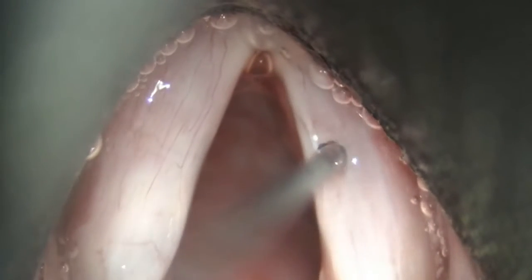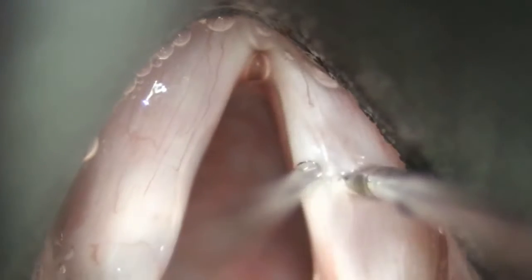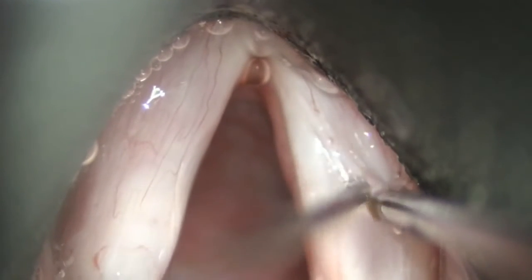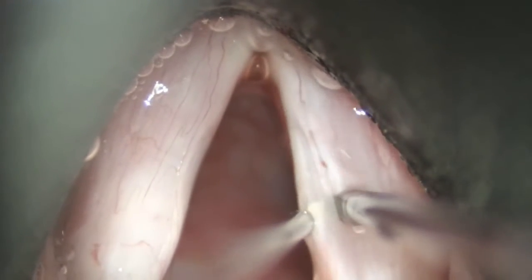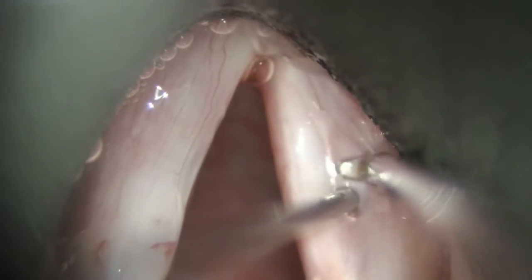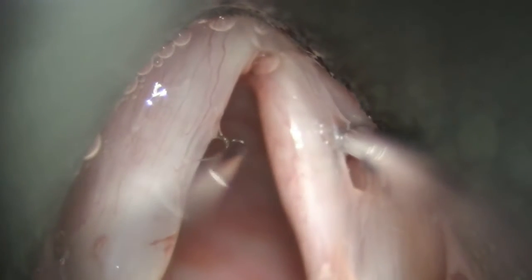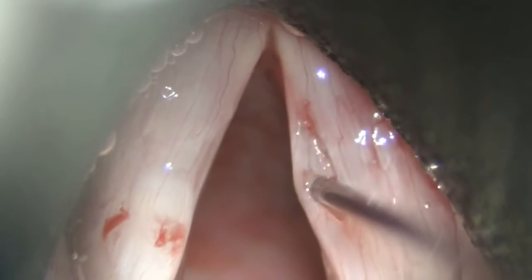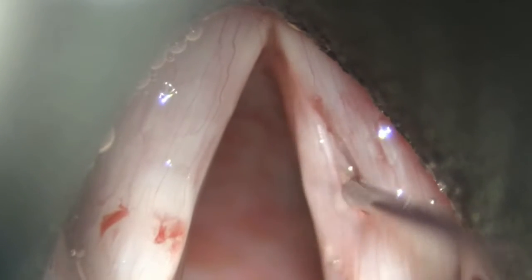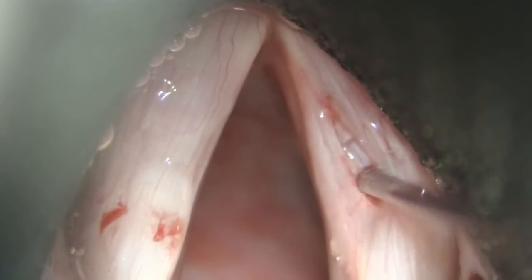A flap elevator is then used to elevate the epithelium of the sulcus from the underlying vocal ligament, or possibly off of the muscle if the sulcus has invaded through the vocal ligament into the underlying thyroarytenoid muscle. Occasionally some muscle may also be dissected up with the flap, as it can be nearly impossible to separate the two, especially in a very scarred vocal fold.